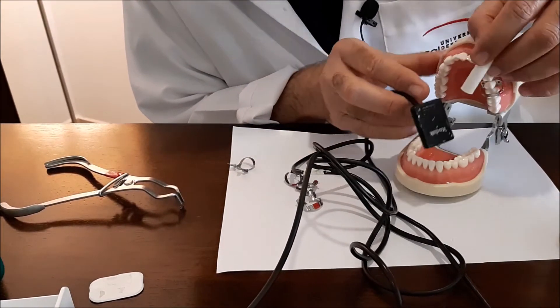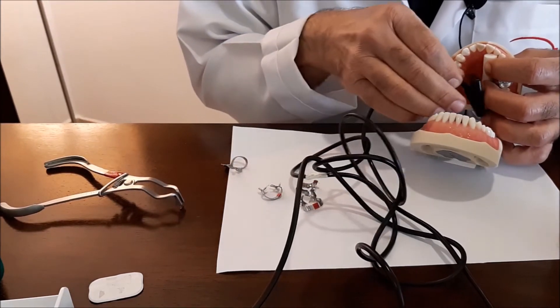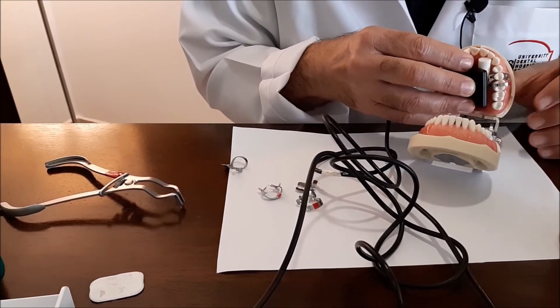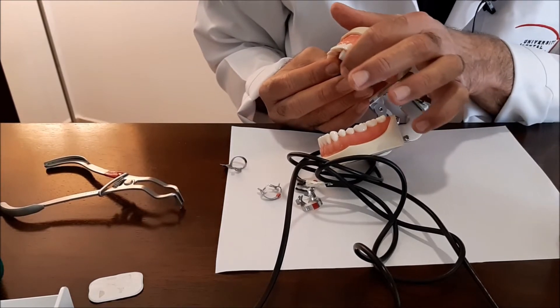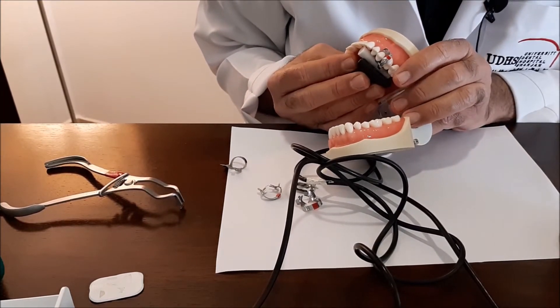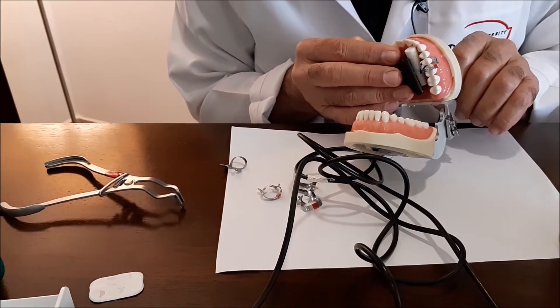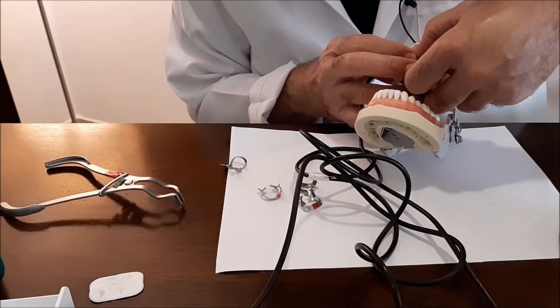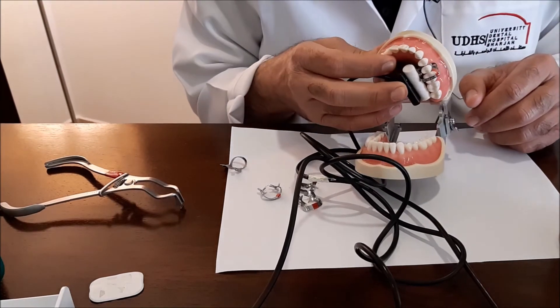Place a cotton roll here, and then you extend the sensor as much as it can go towards the midline. See the relationship now, how much is extending from below the tooth. Now here you will definitely catch the apex plus you don't have this steep angle. You can even make it more correct by placing the cotton roll in between the clamp and the sensor this way.